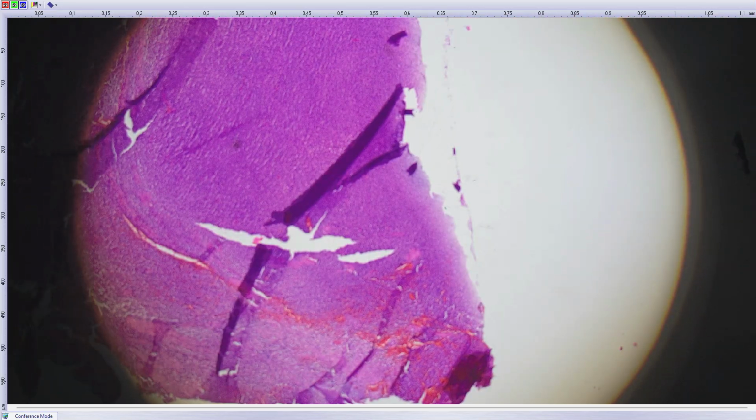Second case, that's a very fancy soft tissue neoplasm, but it's kind of important to be at least a little bit aware of it. It's a lesion in the tonsil of a 70-year-old male.